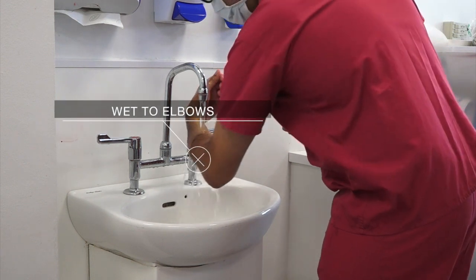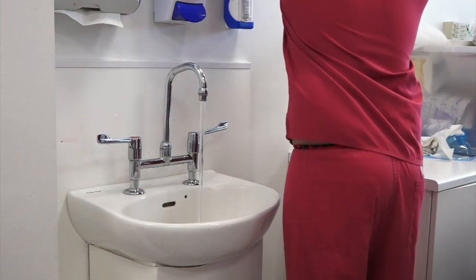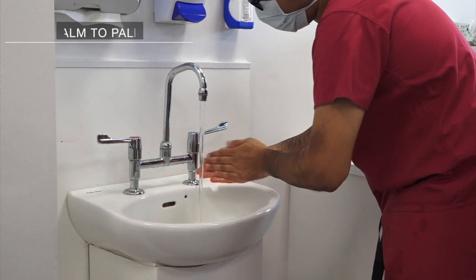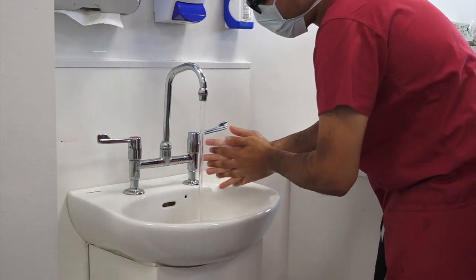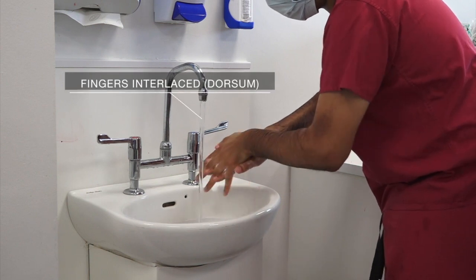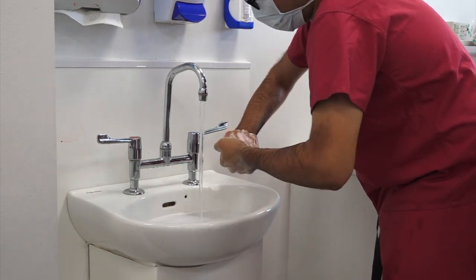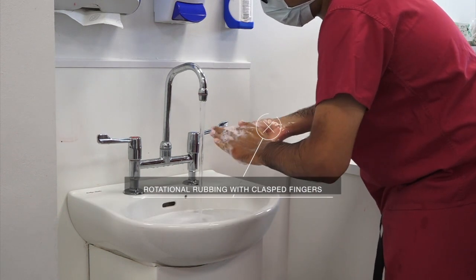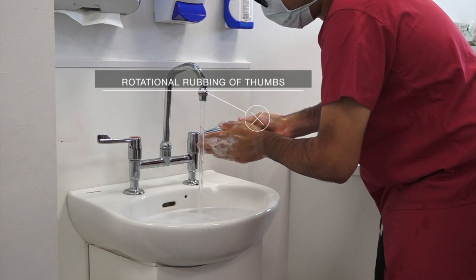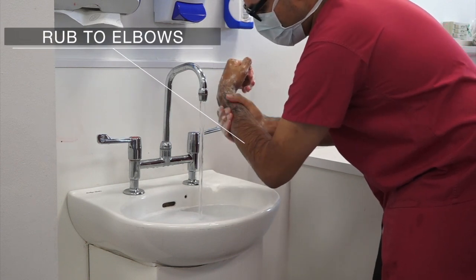Wet your hands and arms all the way to the elbows. Apply sterile surgical scrub soap to both hands. Rub hands palm to palm. Rub palm to palm with fingers interlaced. Rub right palm over left dorsum with fingers interlaced and vice versa. Rub backs of fingers to opposing palms with fingers interlocked. Rotational rubbing with clasped fingers of right hand in left palm and vice versa. Rotational rubbing of left thumb clasped in right palm and vice versa. Continue rubbing up to the elbows while keeping hands elevated above elbows.